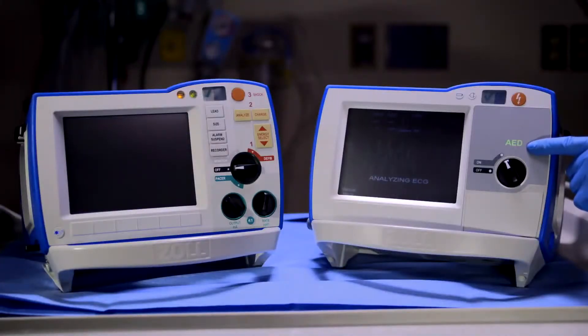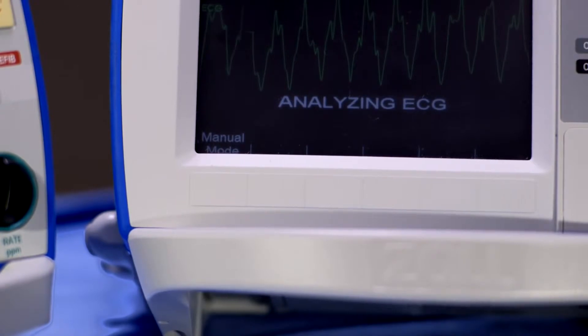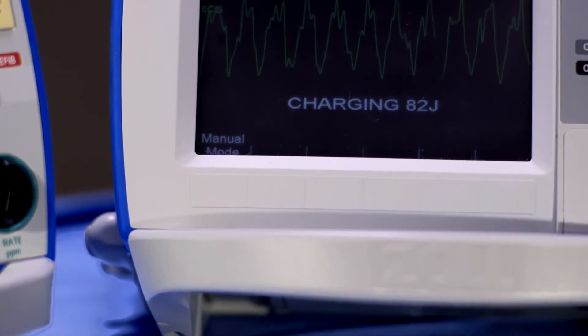The R Series Plus will now function as an AED, providing prompts and feedback, including rhythm analysis and CPR feedback. Follow the prompts provided with the visual and audible alerts.